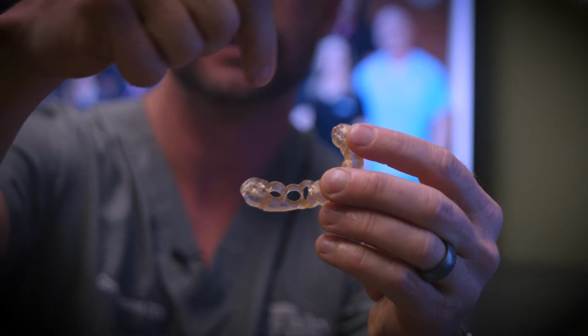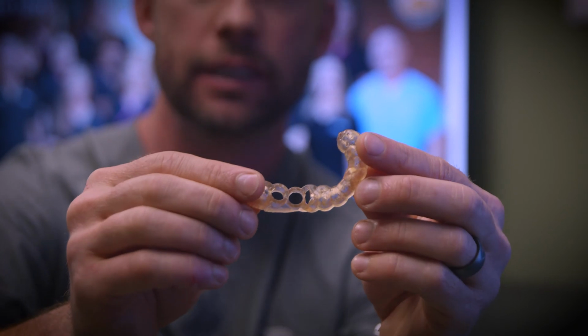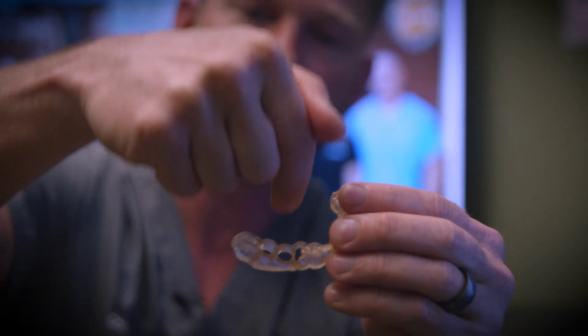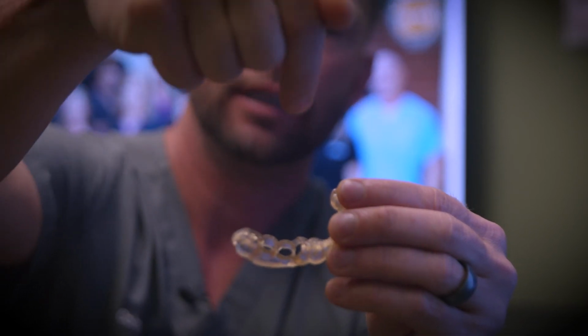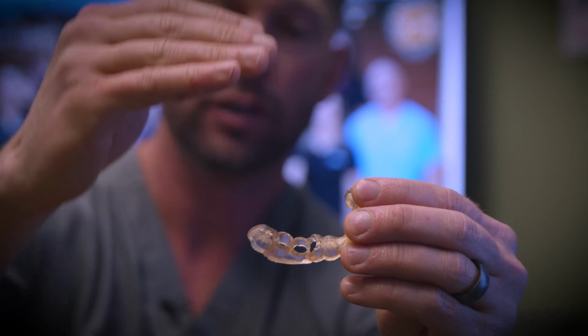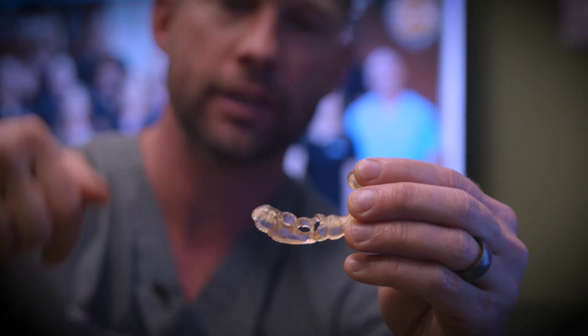And it has the angles and the depth and the location built into it. It'll fit over the teeth, and that keeps my drill sets exactly in line with where I've placed them in the software. Also to the correct depth. I just step through my drills once I've got this in place.